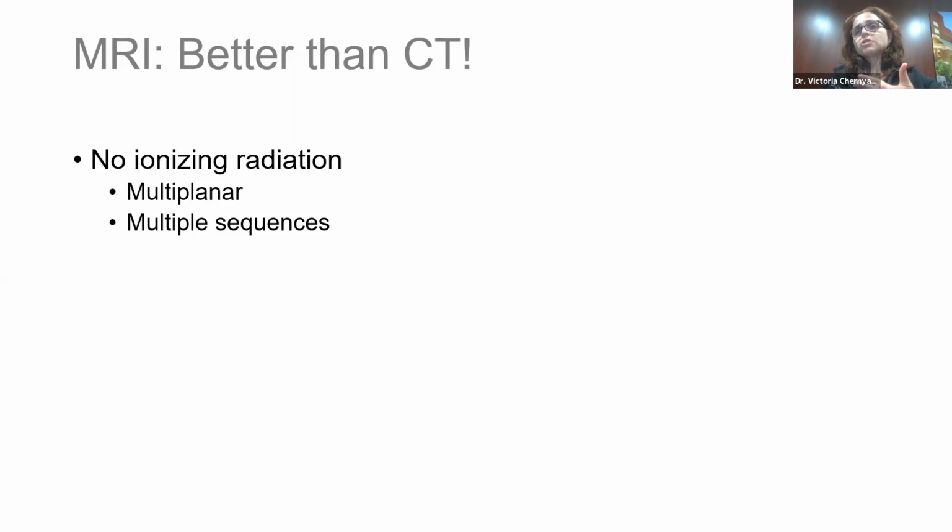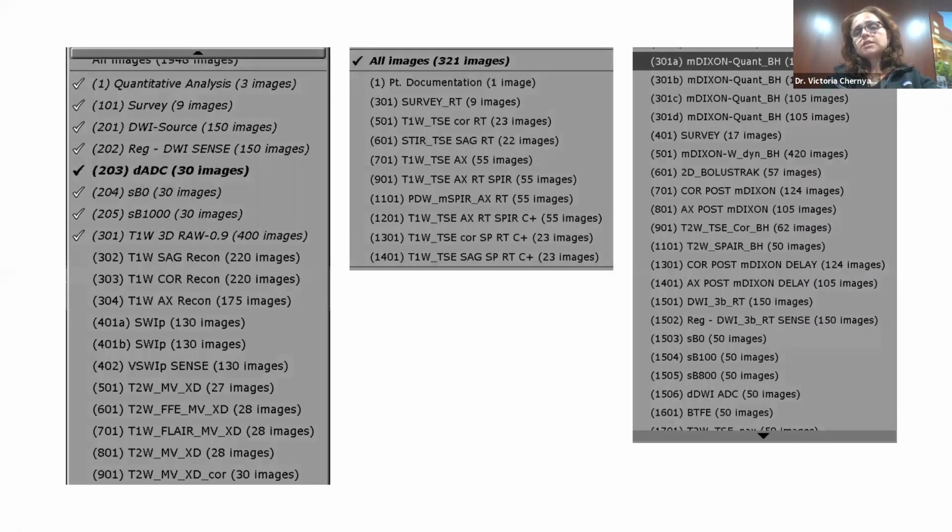We can have the patient lie on the scanner for 5 hours and there will be no downside effects in terms of health, which means that we can acquire multiple sequences that can help us detect certain things and characterize certain tissues in a better way. And we can acquire these sequences in various planes, again, which will help us get a better anatomic view of things.